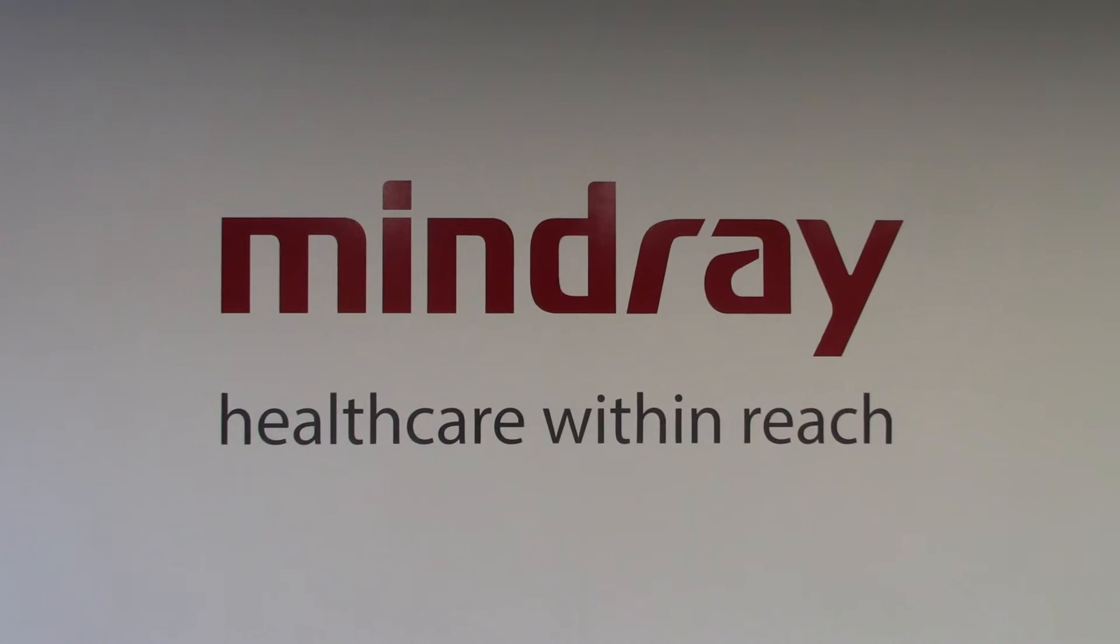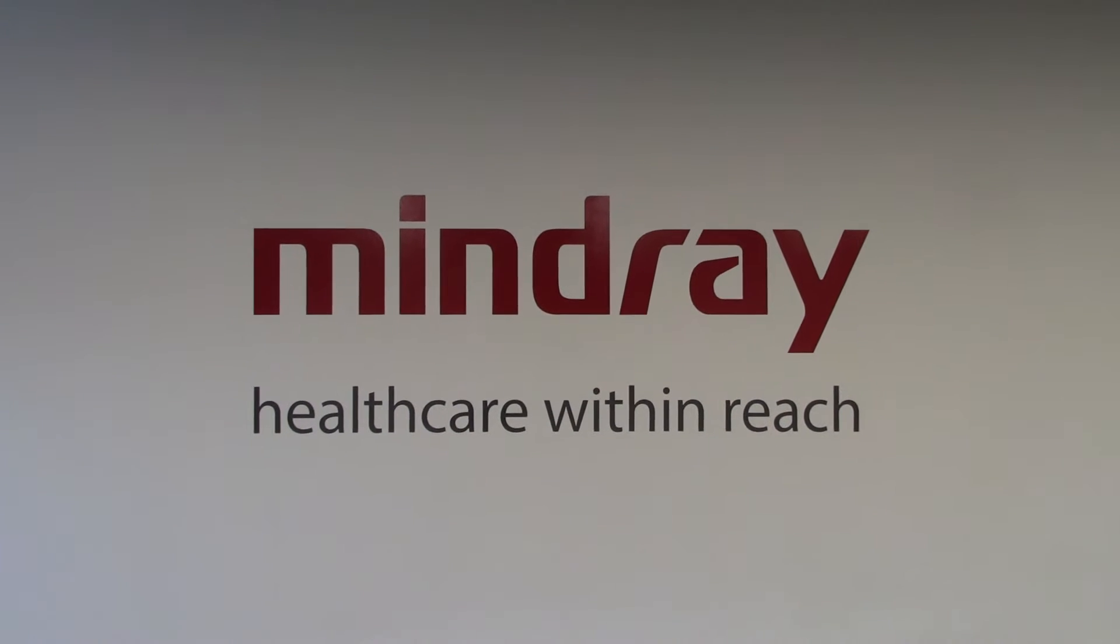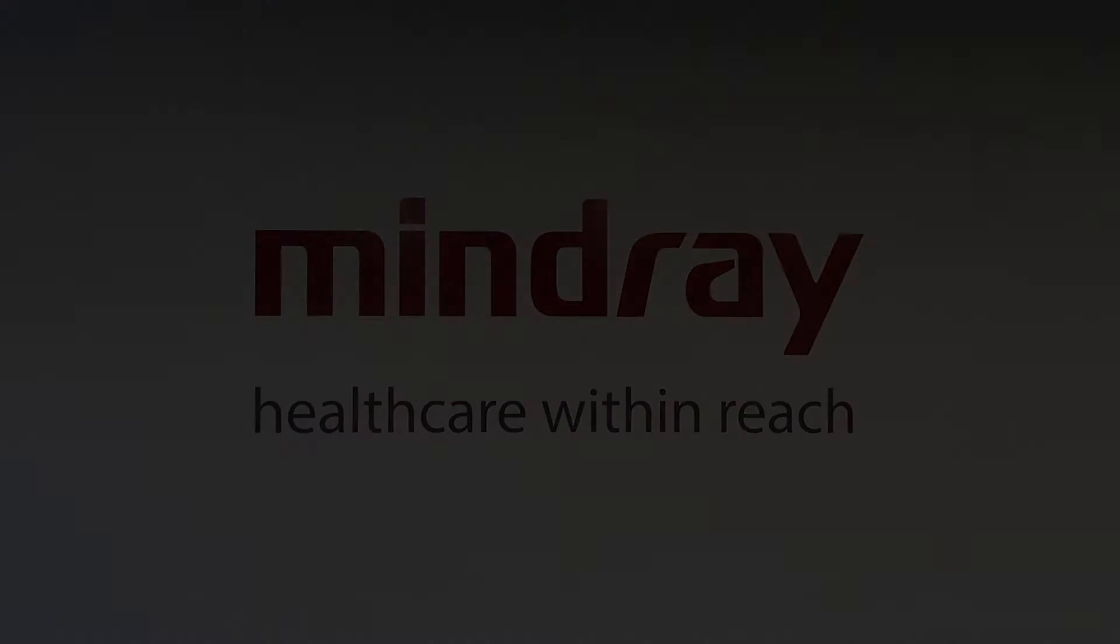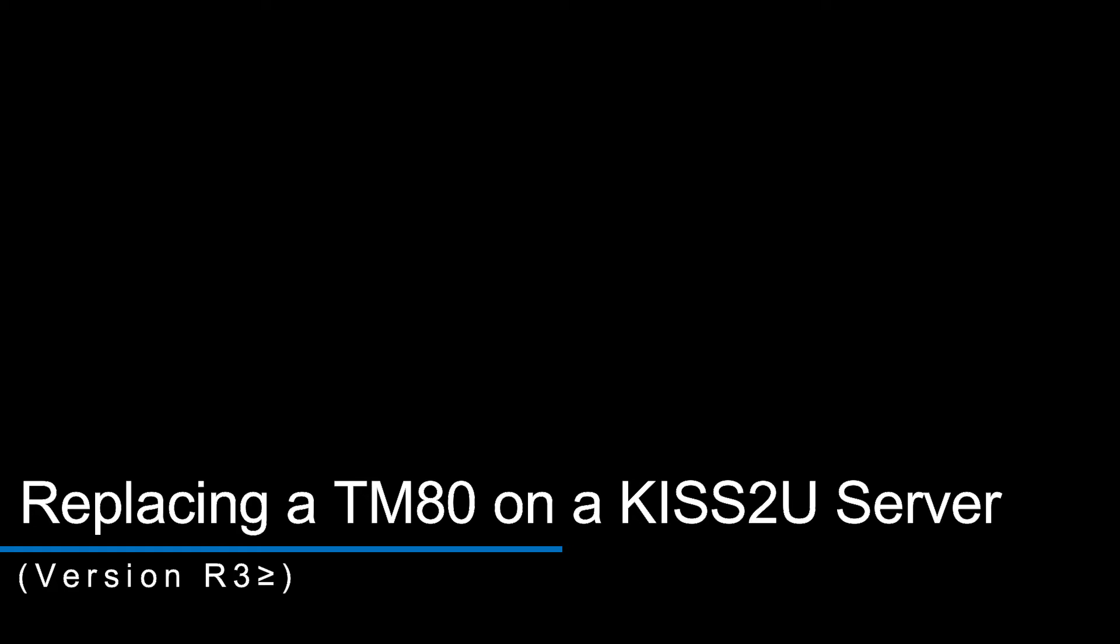Mindray. Healthcare within reach. Replacing a TM80 on a KISS2U server, version R3 or greater.